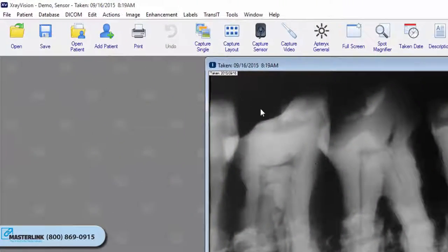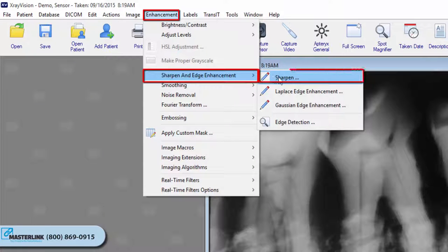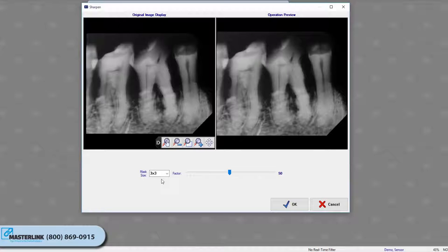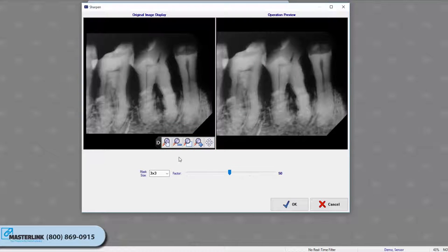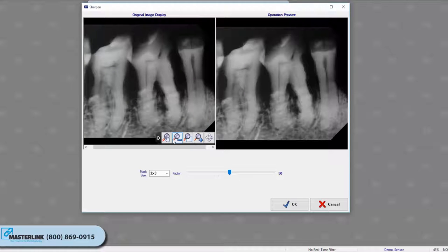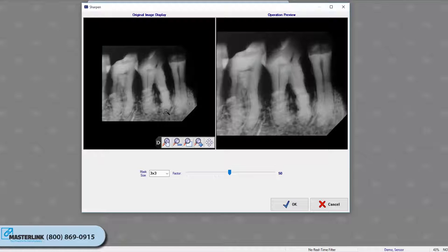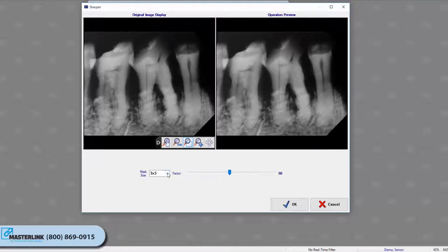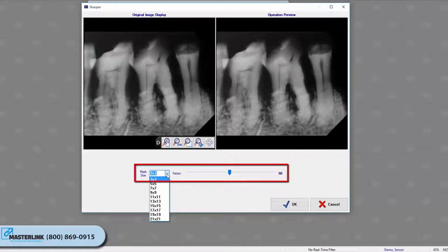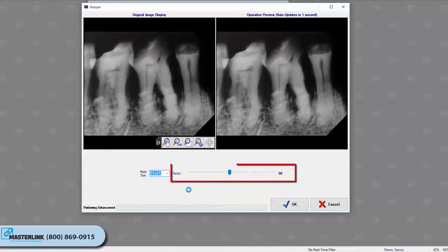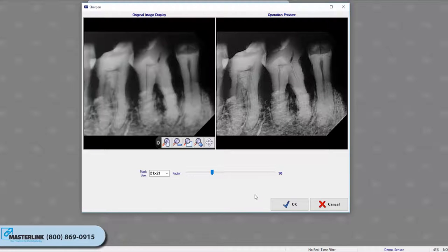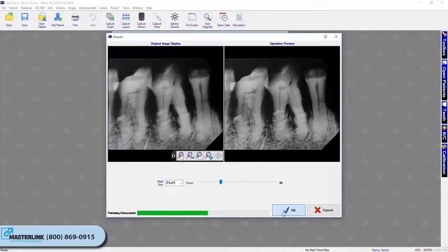To apply sharpening to an image, select Enhancement, Sharpen and Edge Enhancement, Sharpening from the main menu. The Applicable Enhancement dialog box displays. Use the image adjustment buttons to size, resize, or reposition images in the original and resulting preview windows. To increase magnification, click with the left mouse button; to reduce, click with the right mouse button. Click Auto Resize to fit the image in the viewing area. The mask size and sharpening factor work together to determine the degree of sharpening applied. Use the slider to manually adjust the degree of sharpening. Click OK to apply, then click Save to store the changes.